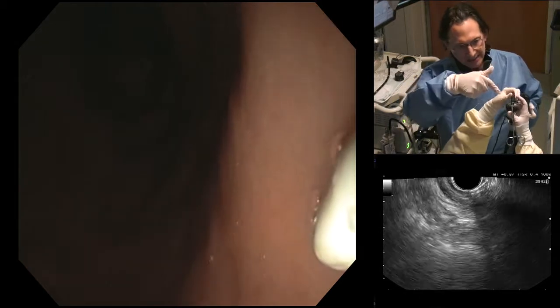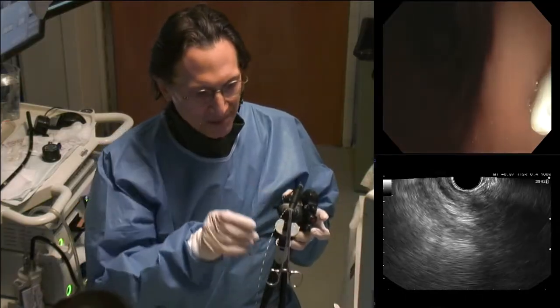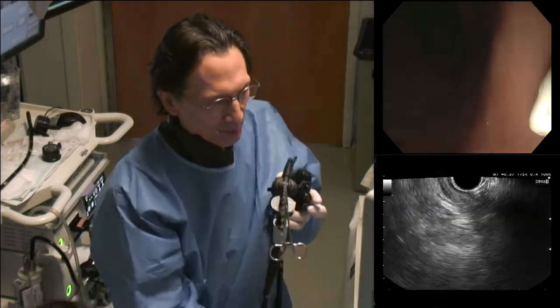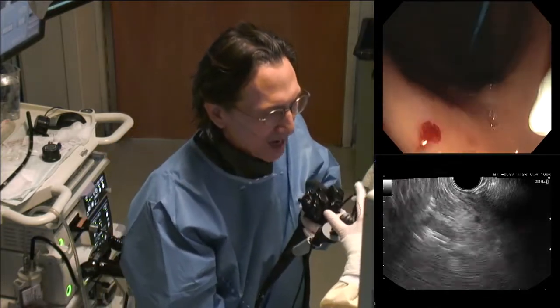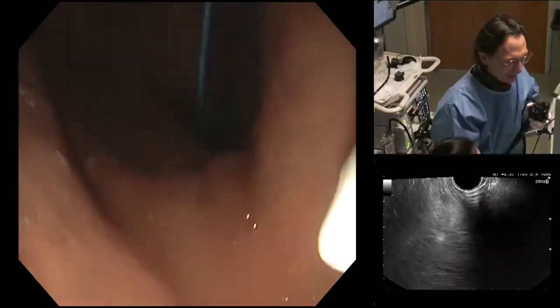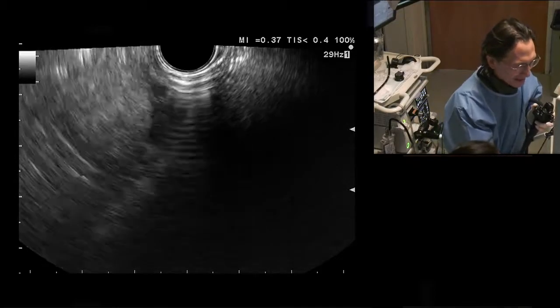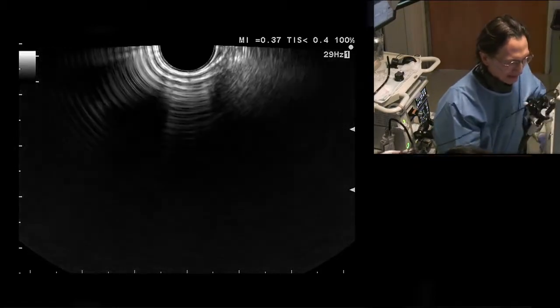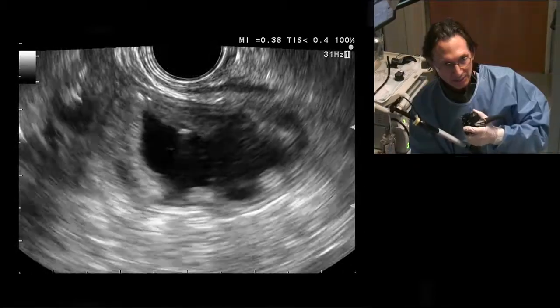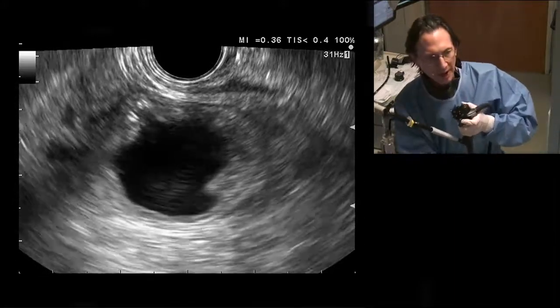You see here that our nurse is attaching our cable to make this hot, and we're going to be using pure cutting current. But the first thing we need to do now is find that loop of bowel that we were just looking at, and that may not be so easy. We have to look for that again. This is actually pretty good. Can you hold this, please? We'll give a little bit more water to fill this up.